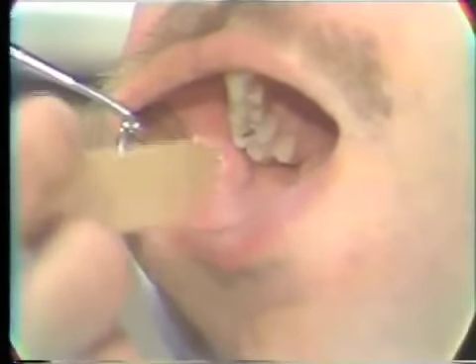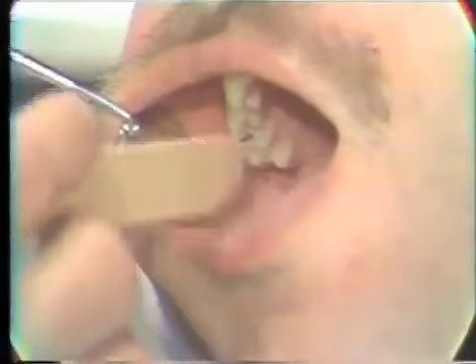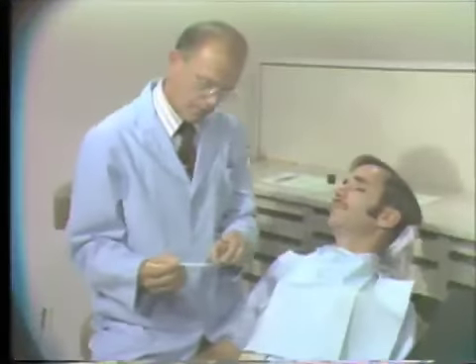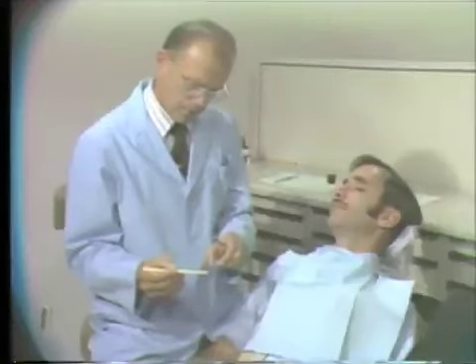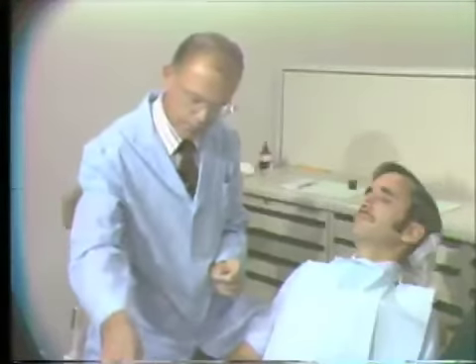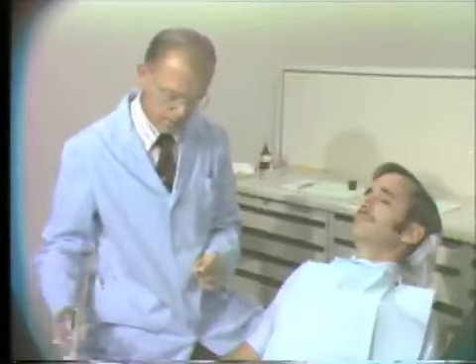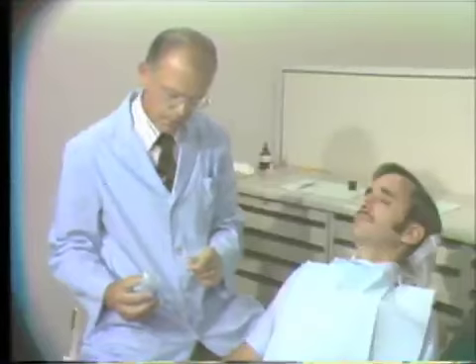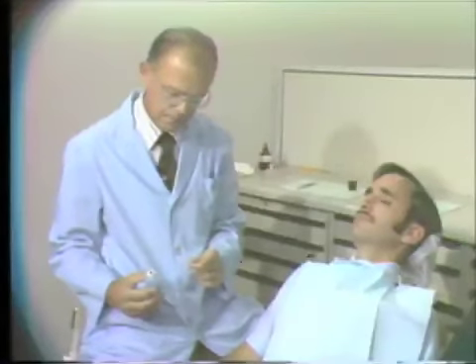It's important that we get cells down at the bottom or the base in order that we have those that are developing and maturing rather than those which are entirely keratotic from the surface. After we have spread the material thoroughly on the surface of the slide, we will fix it as quickly as possible so that the character of the cells does not change.